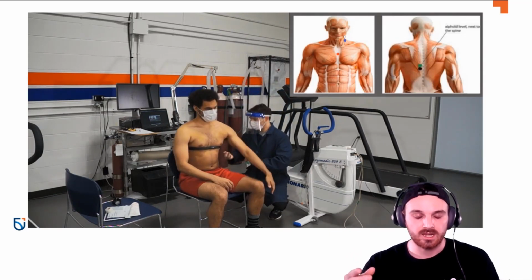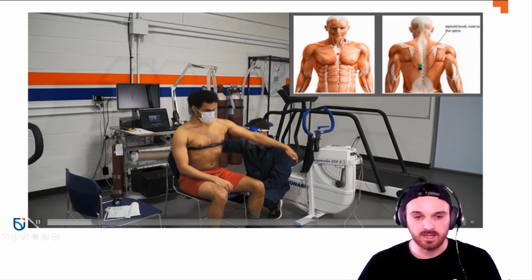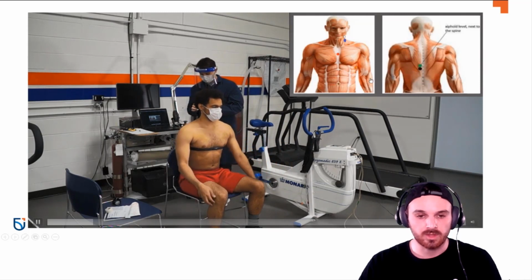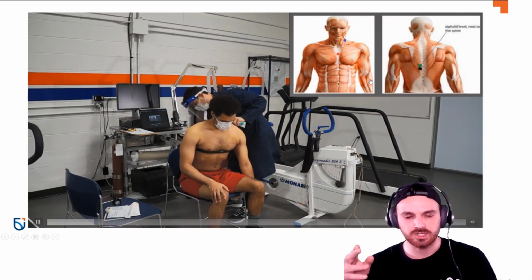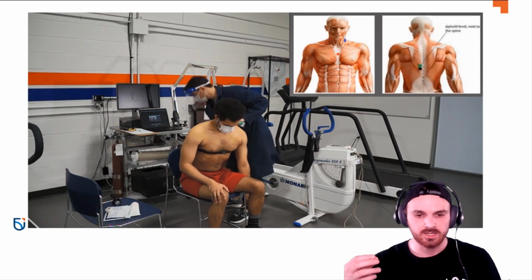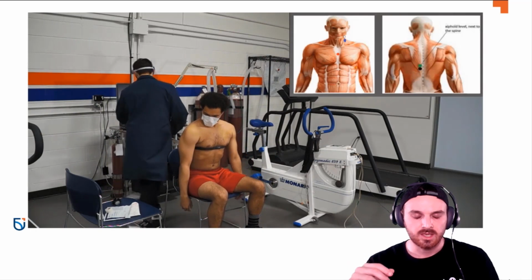So I abrade each area that is listed here. So here I'm doing the under axillary in the orange, and then the 2 on the back. And as I do that, I'm rubbing it in. It's kind of like a toothpaste where it's a little gritty. So like I said, it kind of takes off some of those dead skin cells.